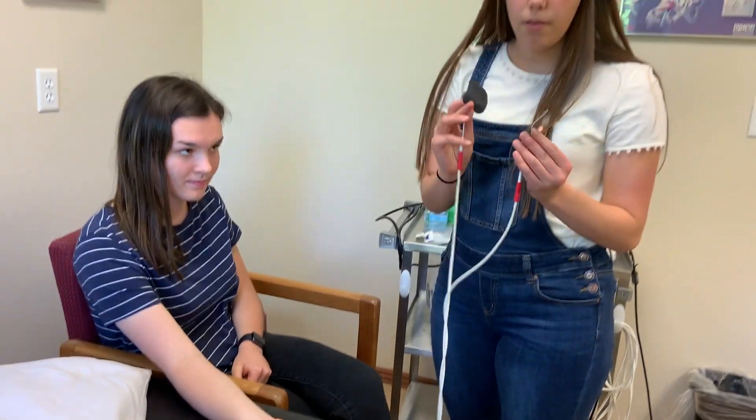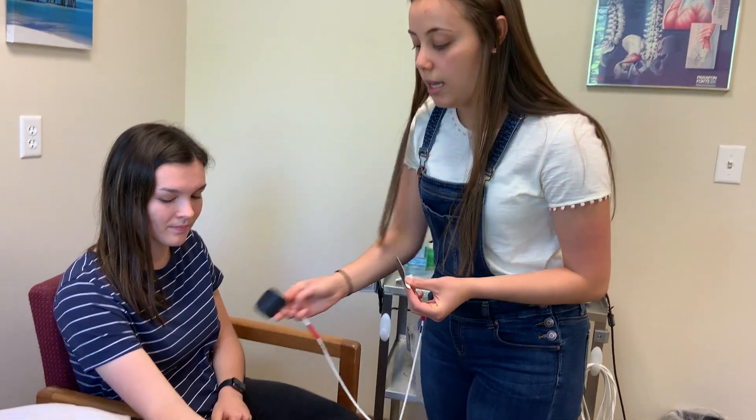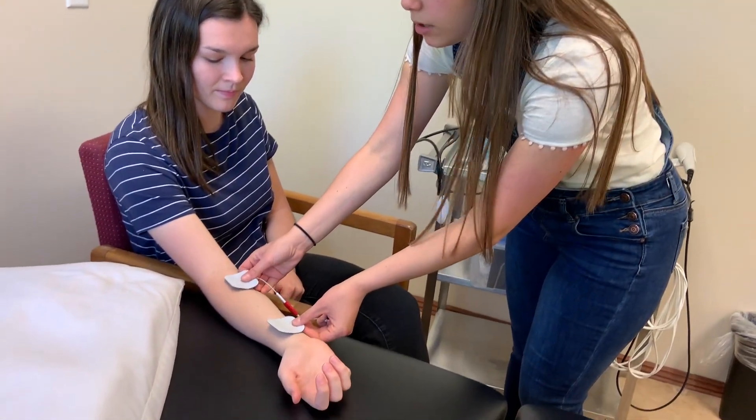For the arm, I've already sterilized the pads and cleaned the area, so I'm going to put them right here and here. When doing Russian or any other electrical stimulation, pad placement is important — but particularly with Russian, you want to make sure the pads are directly on top of the muscle you want to contract. If they are too close together, you won't get enough depth into the tissue. Make sure they're not crossing into other areas, but get them wide enough to allow the muscle to contract.